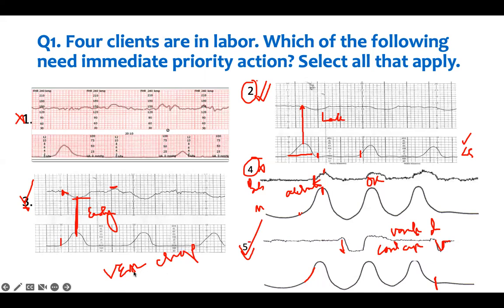And then acceleration is okay. And late deceleration is placental insufficiency. And you have to know how to manage each of them. And so that is the way to do this.